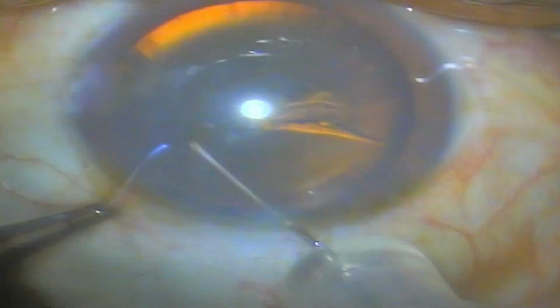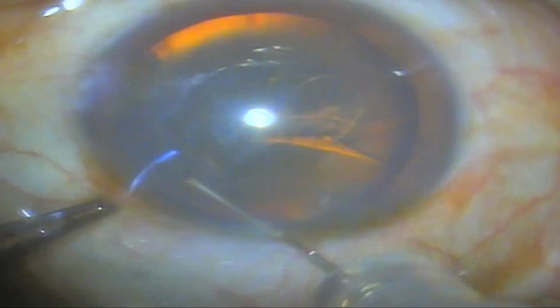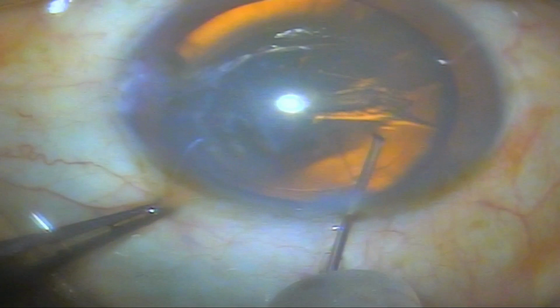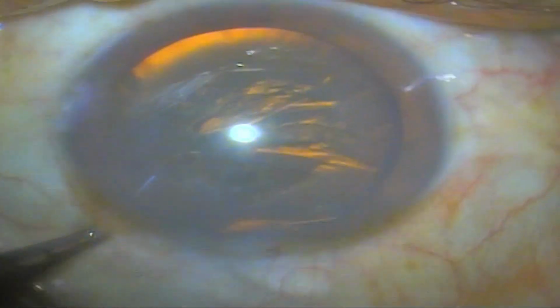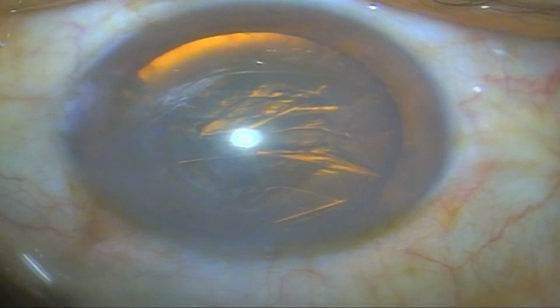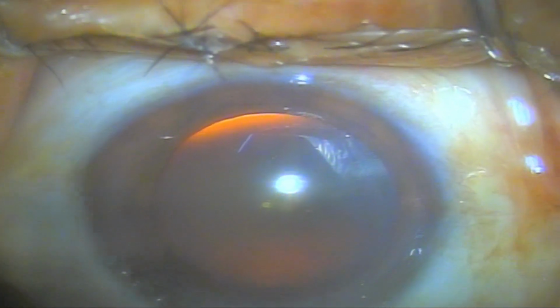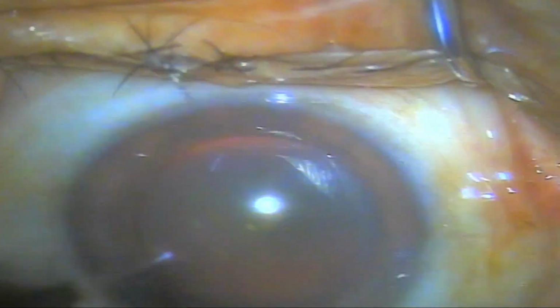In this case, you can also see that as soon as the cystotome completes the rhexis and comes out of the eye, along with the flow of aqueous humor, the anterior capsule also plugs the cystotome port and prevents the collapse of the anterior chamber. The anterior chamber is well formed, and in the presence of very good intraocular pressure, we can make a full thickness corneal incision with the help of a keratome, a diamond keratome.